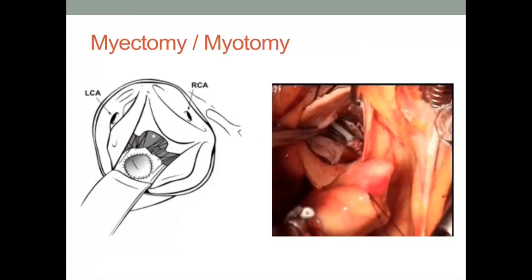In instances where preoperative evaluation has also revealed subaortic narrowing or obstruction, a concomitant myotomy or myectomy, in addition to aortic valve replacement, may be an option for an anatomically and physiologically adequate left ventricular outflow tract. Exposure is obtained as has been previously described by either an aortotomy or by a complete transection of the ascending aorta. The coronary artery ostia are then well defined to avoid any iatrogenic injury. In addition, the valve leaflets, commissures, and area of the presumed conduction system are also well identified and protected during the process of myectomy or myotomy.